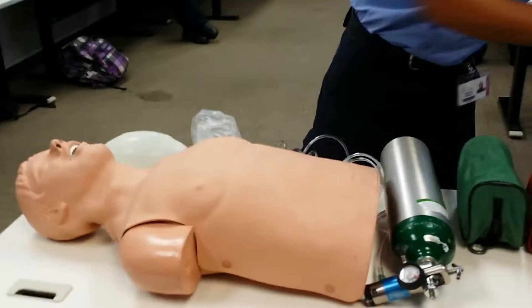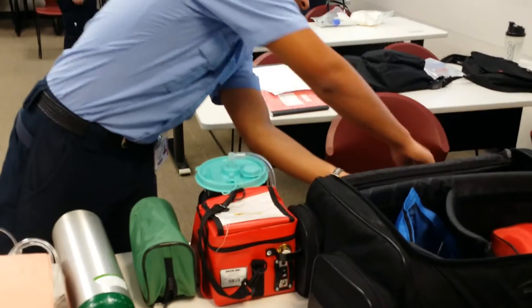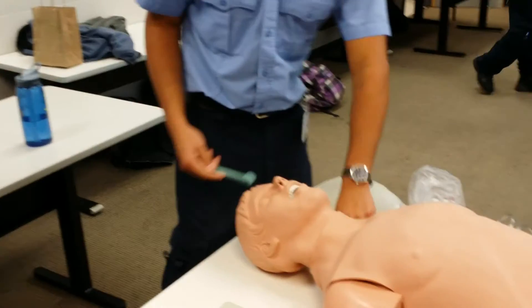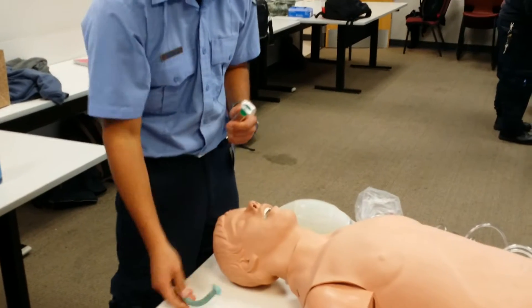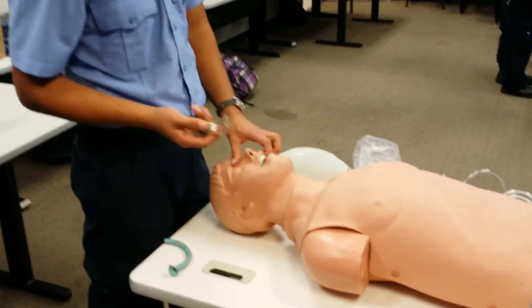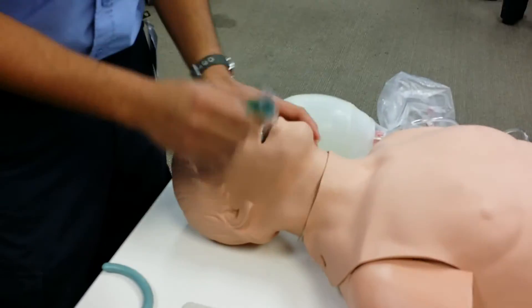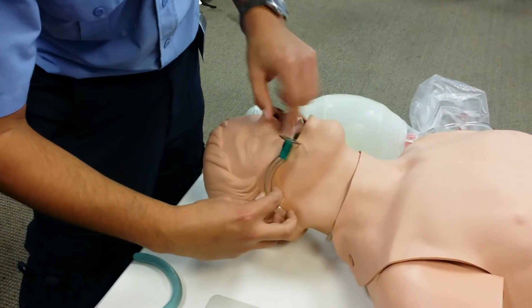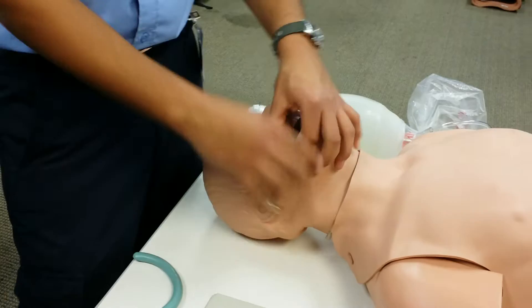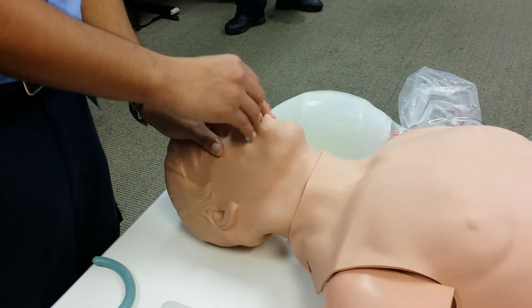So I'm going to start rescue breathing. Before I start rescue breathing I'm going to get my BVM with two little friends. This is going to be my OPA — oral pharyngeal airway. And this is going to be my NPA — nasal pharyngeal airway. Before I do this, I'm going to want to size the OPA — going to the corner of the mouth to the edge of the ear. And I'm going to place it inside the mouth — going hard palate to soft palate, then turn 180 degrees.